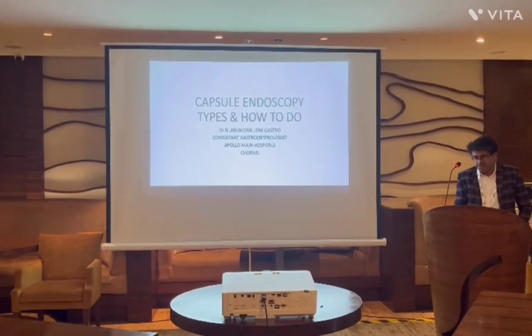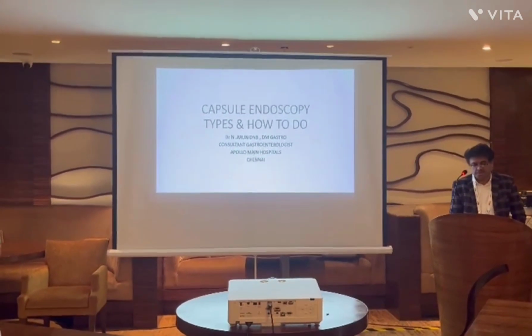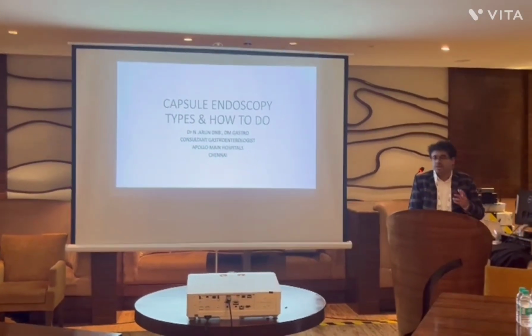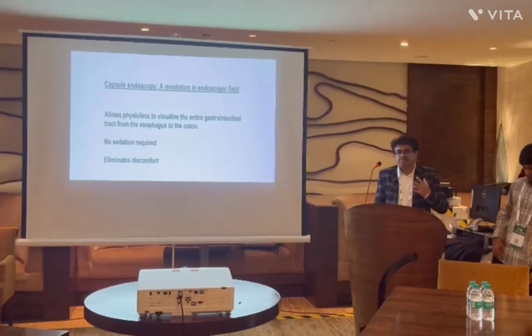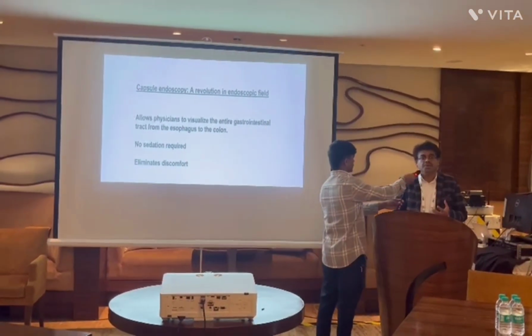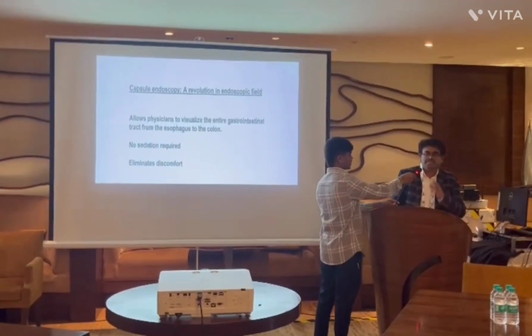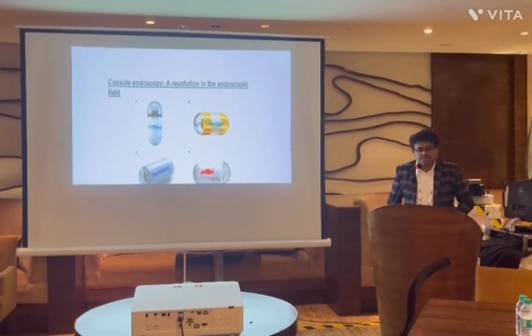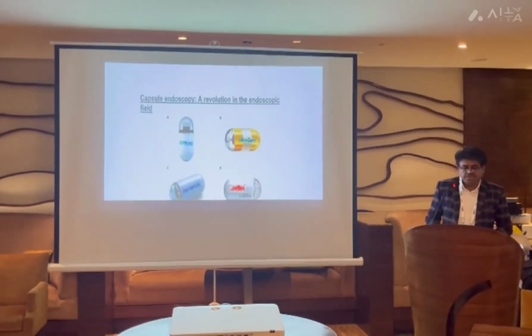Today we are here to take on the discussion on capsule endoscopy, and my role is the various types and how to do the capsule endoscopy. As already discussed, capsule endoscopy has right now become a major innovation in the field, mainly to evaluate small bowel lesions. Apart from that, there are three major things we should not forget. In capsule endoscopy, the previous speaker has already discussed most of the things.